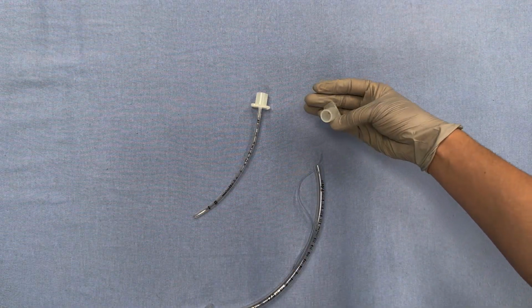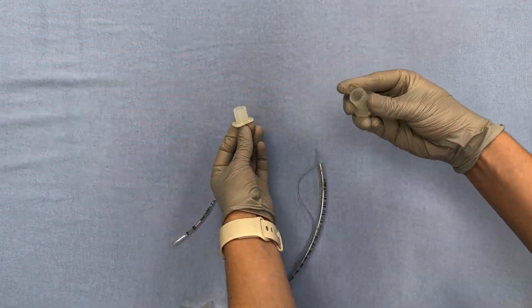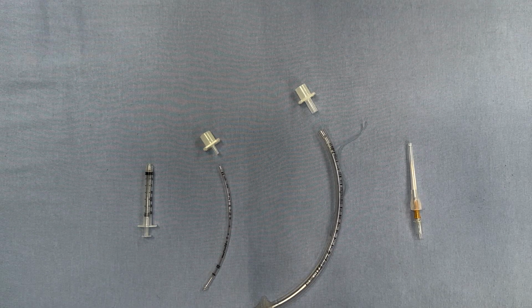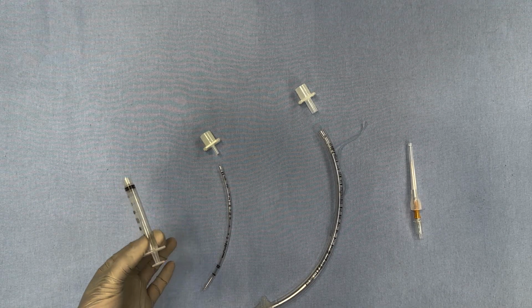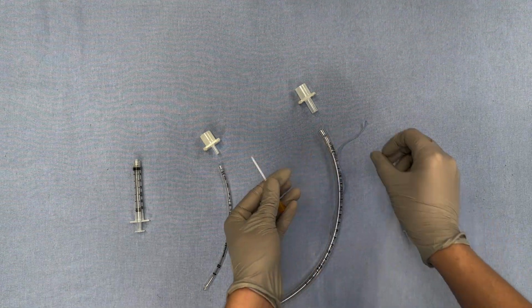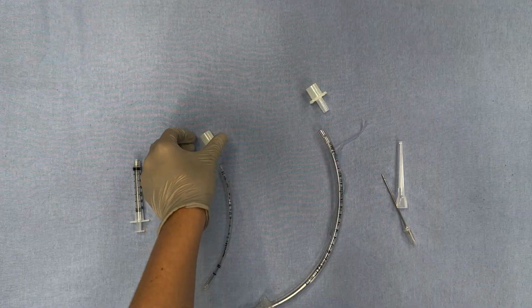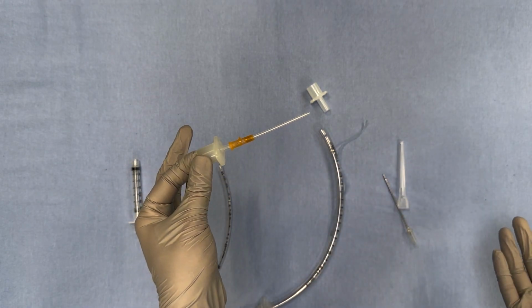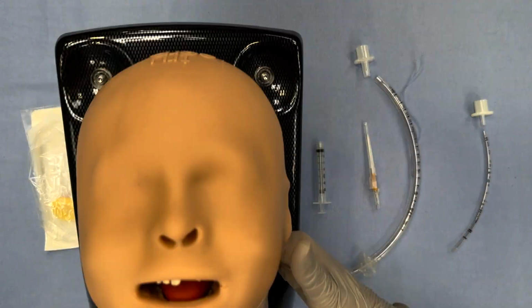The option you choose really just depends on your preference and what you have available to you. The 7-0 is much more common in the ED than the 3-0, so you might just want to remember the 7-0 setup. With this setup, you will need to grab a 3 ml syringe because the 7-0 adapter doesn't attach directly to the catheter. If you go with the 3-0 ET tube adapter, then you can directly attach it to the 14-gauge catheter. Now that you're familiar with the setup, let's practice on an infant.